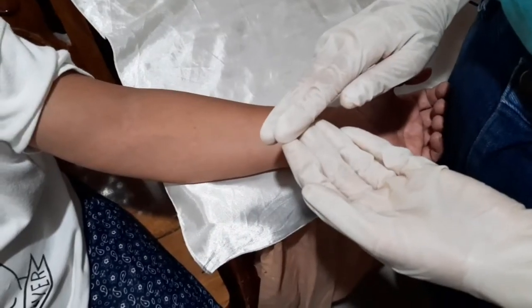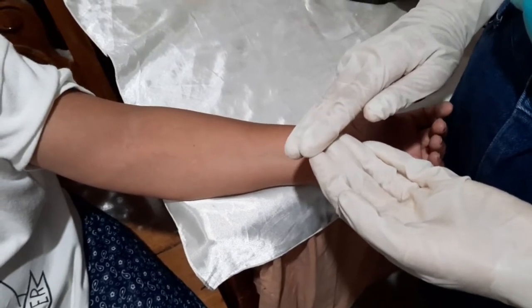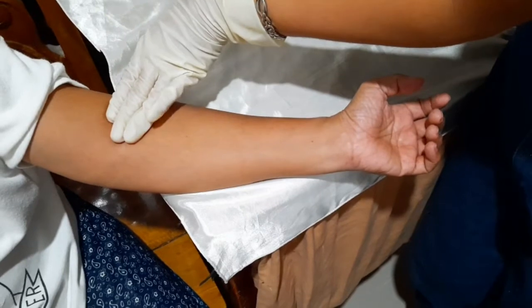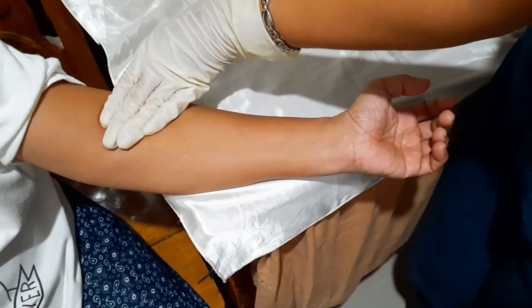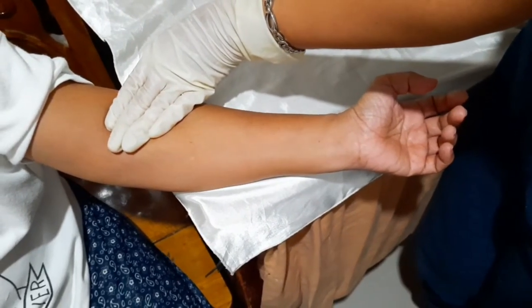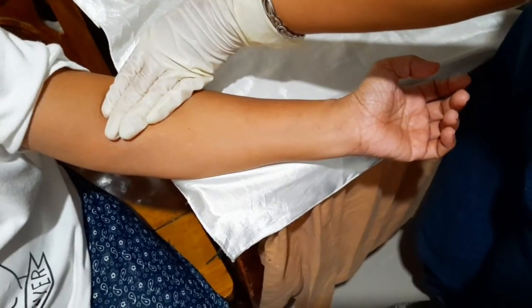Now, we're ready to do our intradermal injection. So to find the location, you're going to go 1, 2, 3, 4 fingers down on the forearm, making sure that the patient's arm is flat and resting on a surface like a table.